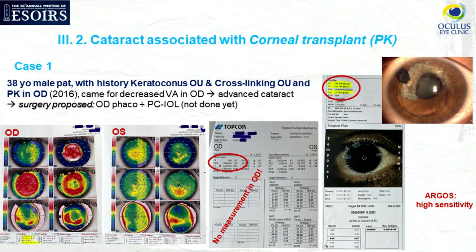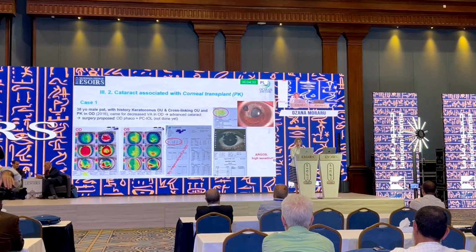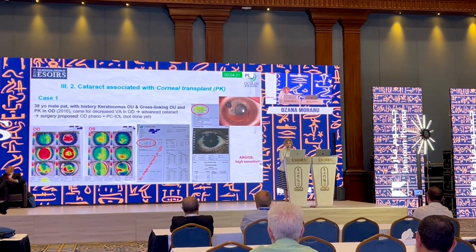And this is another case on corneal transplant. You can see in the right eye he had this corneal transplant, no measurement in the right eye, no axial length because he had some cataract, and no K readings, but Argos did measure both of them, so it has a high sensitivity. The patient hasn't had surgery yet.